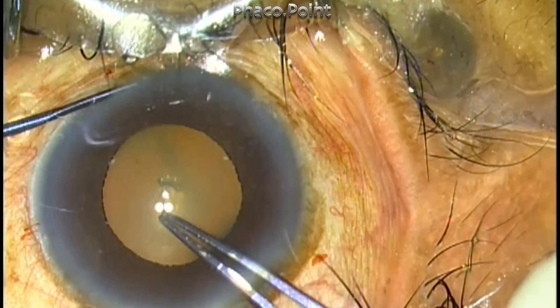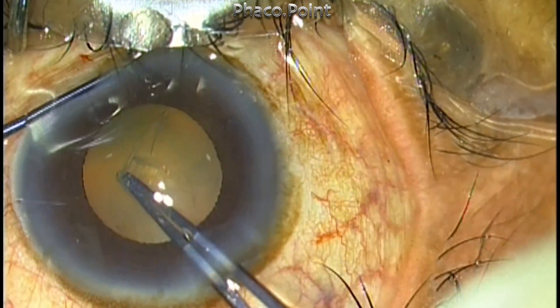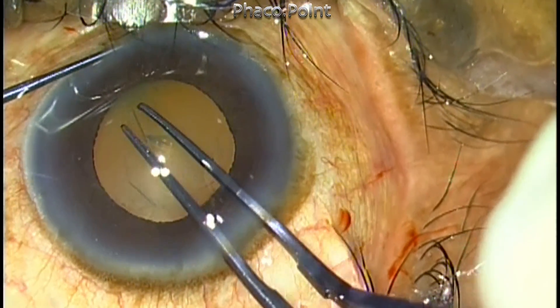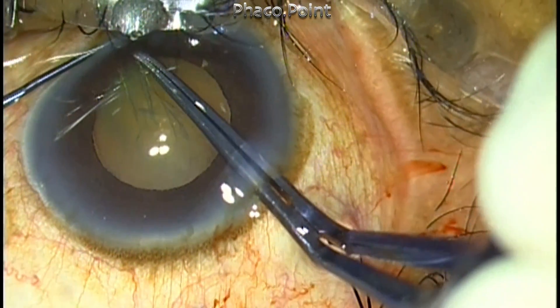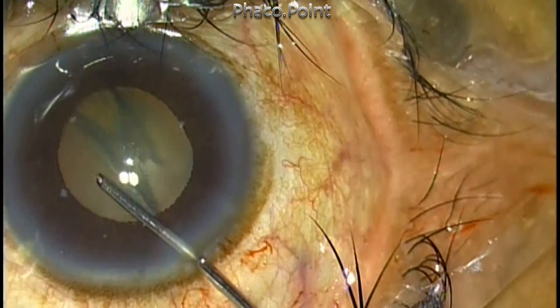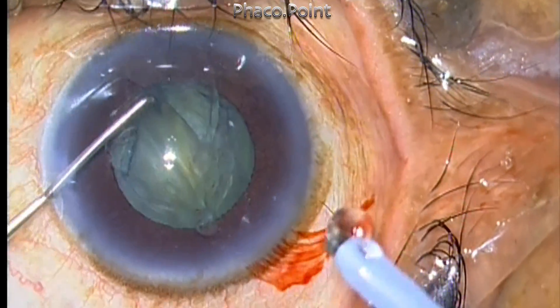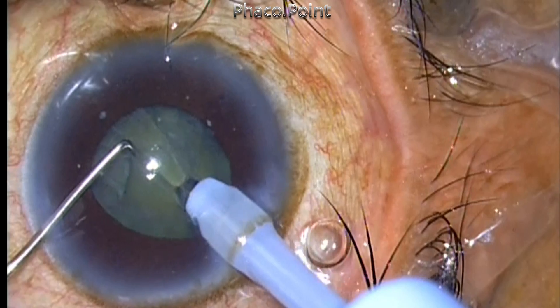In the first case, the patient had a pupillary size of around 4.5 mm with a grade 2 nucleus sclerotic cataract. Remember that if the cataract is very soft or very hard, it is better to use pupil dilating devices. The capsulorhexis is performed with the help of a Utrata forceps, aiming for as large a capsulorhexis as feasible. A very careful cortical cleavage hydrodissection is performed, as it is critical that the nucleus rotates to make management of the case easier. The pupil size is around 4.5 mm at the start of phacoemulsification.